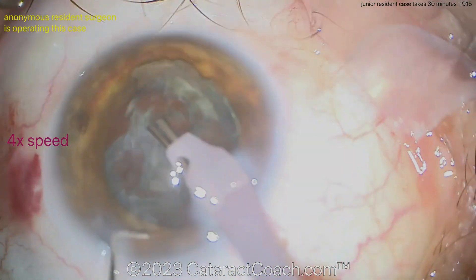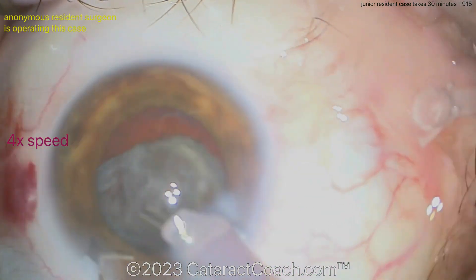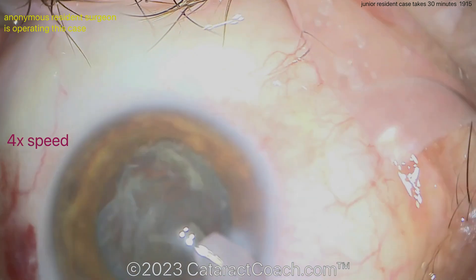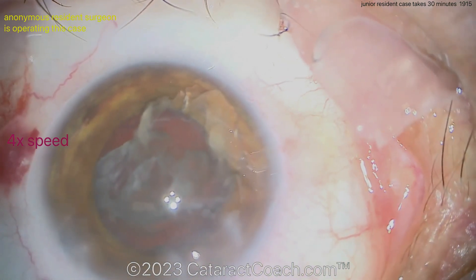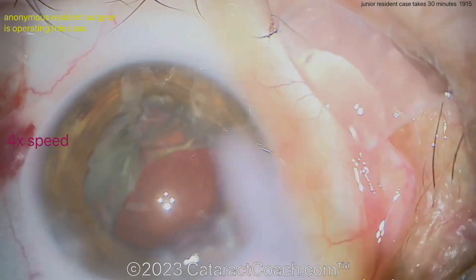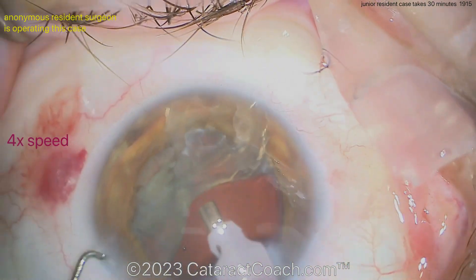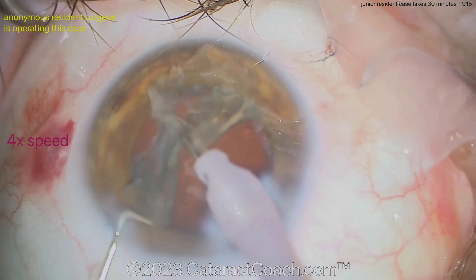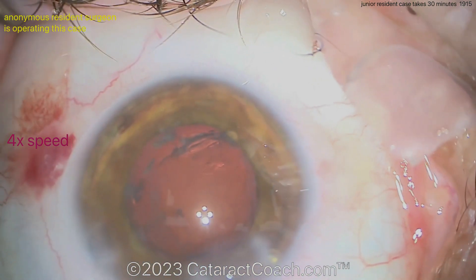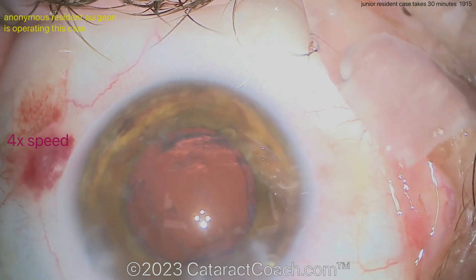The epinuclear shell is going to be a little tougher. I like that technique, but you may want to use your second hand — having a second hand inside the eye will make life a lot easier. More viscoelastic underneath it — viscoelastic is cheaper than losing things. There's the second hand, that's what we need. Get this out of the eye and nicely aspirated. Good job here.